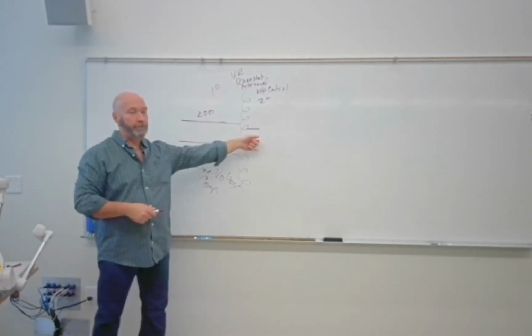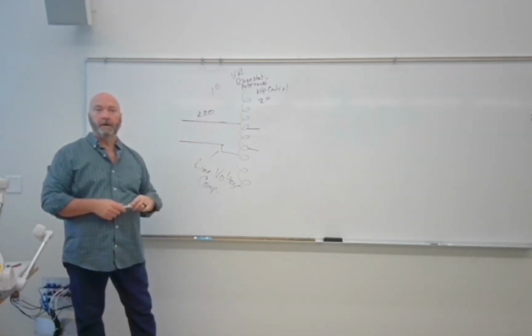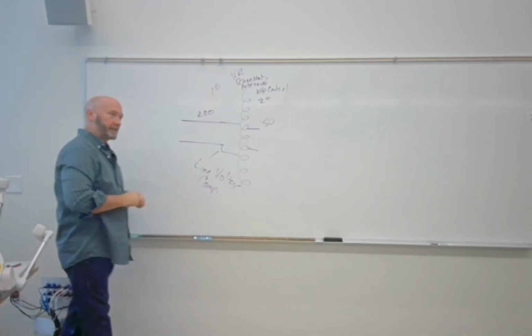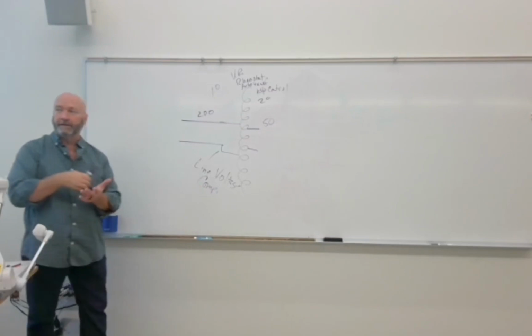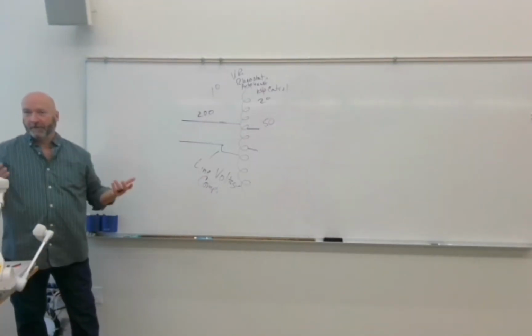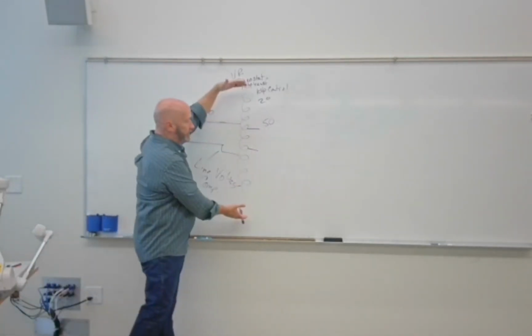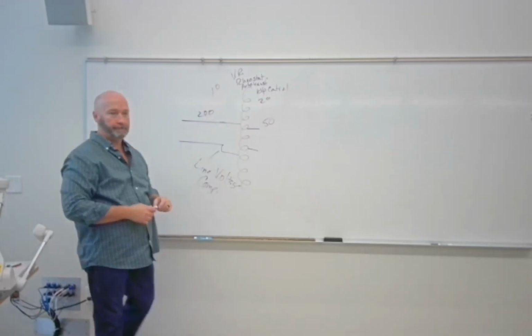So if I use 1/4 of them and I started with 200, what's 1/4 of 200? 50, right? So I feed it 200 volts. Now I've got 50 volts over here. And this is a lower kVp than you're ever going to use, but let's just use it for this particular example. Let's say we're doing a pediatric finger. Don't need a whole lot to penetrate a 3-year-old's finger, right? So in that way, by spreading those out and bringing them together, I control my kVp. But do I have kVp yet?